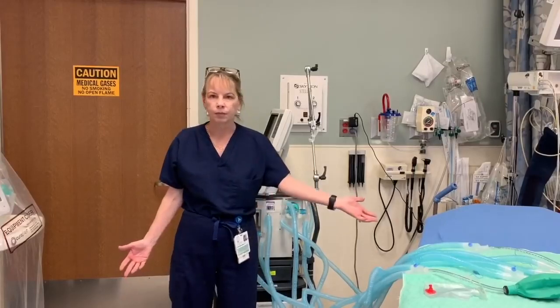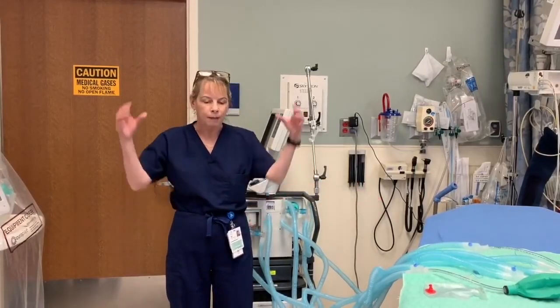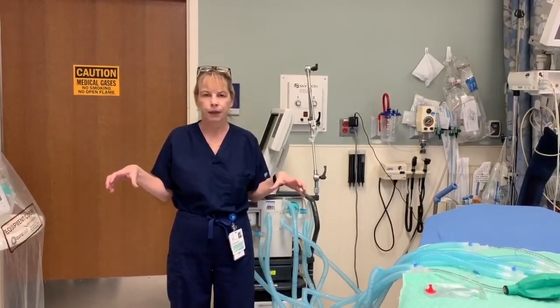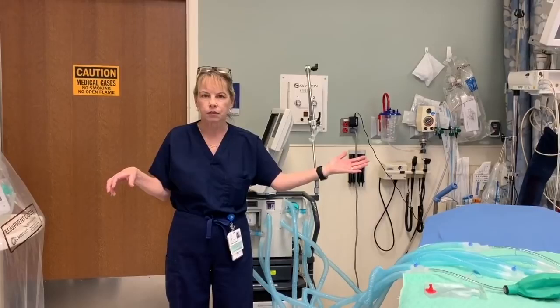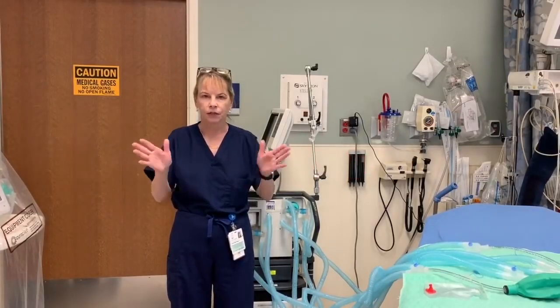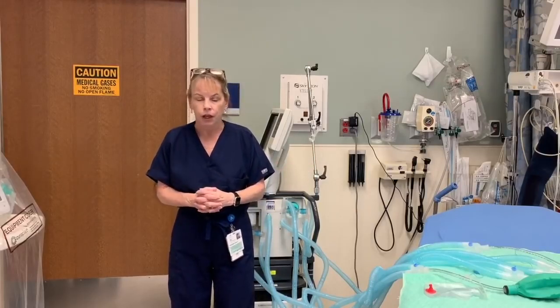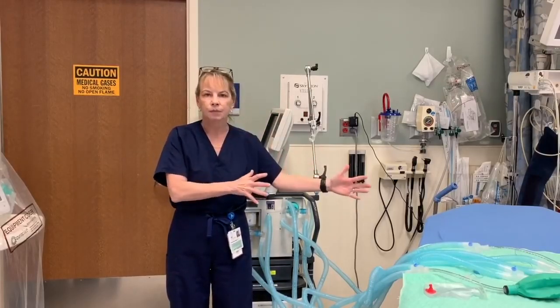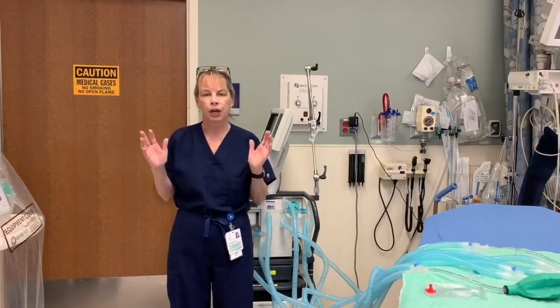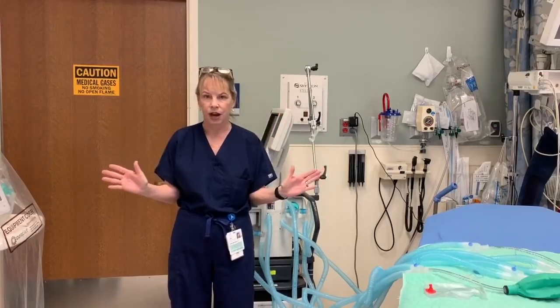But how do you use this information, since it's only been done on a test lung? There are a few things that are somewhat intuitive. First, you want to make sure the lung sizes are the same across all portions of the circuit — you wouldn't want to put a pediatric patient with an adult patient. Likewise, you want to make sure the resistance is the same; you wouldn't want to put a patient with severe bronchospasm with a patient who did not have bronchospasm, as that could affect the volumes delivered to each patient.